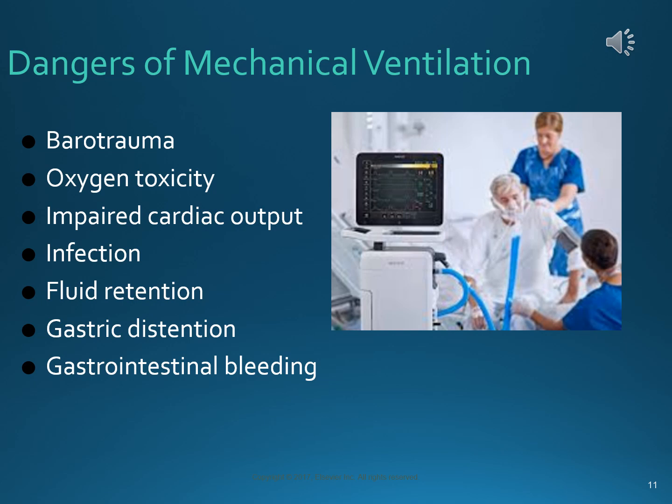Infection, obviously. If you've got somebody who is being suctioned a lot and perhaps people aren't careful about their sterile technique, fluid retention, gastric distension from all of the extra air. Sometimes it's just like with CPR, if you blow too much or too hard into the patient's lungs, that epiglottis will open and it'll go down into your stomach.